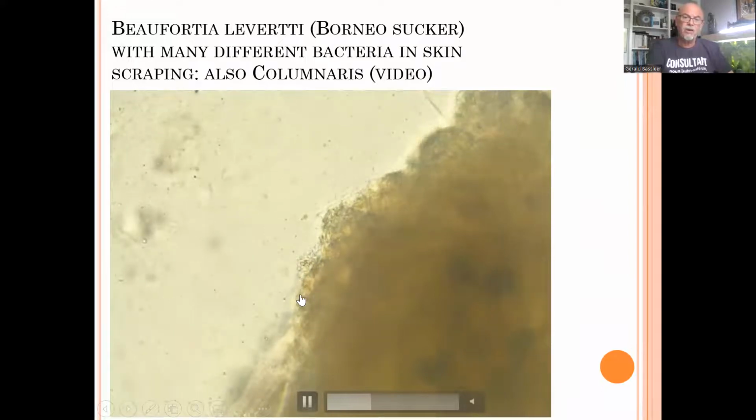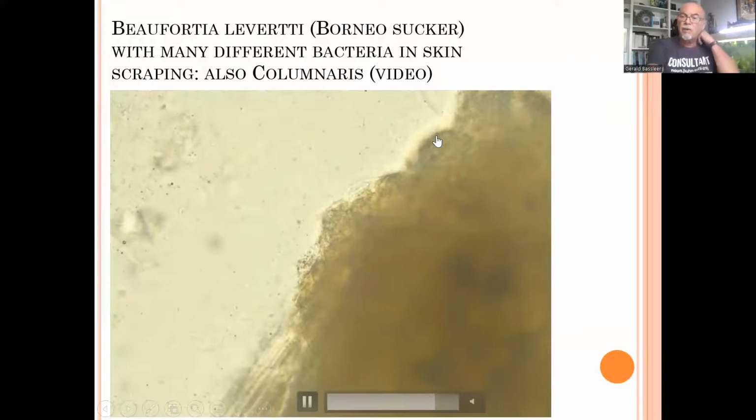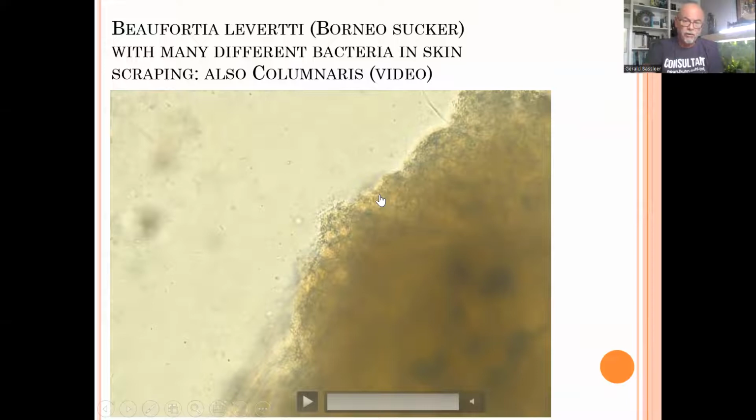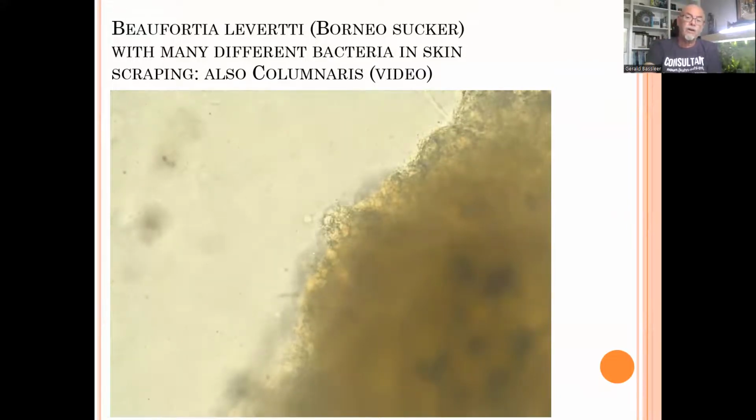And we also can see here in the necrotic tissue colonies of Flexibacter columnaris or Chondrococcus columnaris. It's a typical bacterial infection that evolves very fast, and it looks like tubifex worms all sitting clustered together, very tiny moving bacteria making these clusters, and it looks like tubifex balls. So that's how you can recognize it. So we can see there are different kinds of bacteria involved in this fish tail rot. So it's not one kind of bacteria.